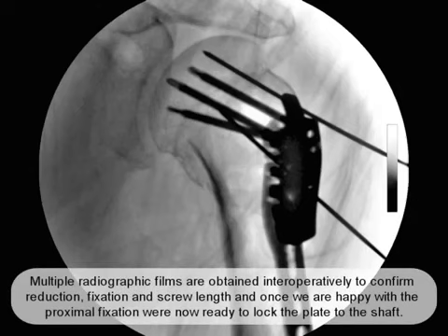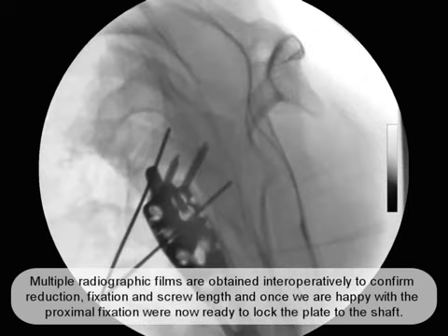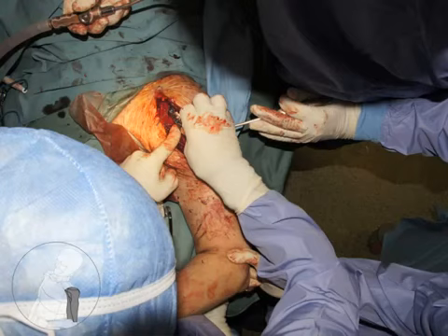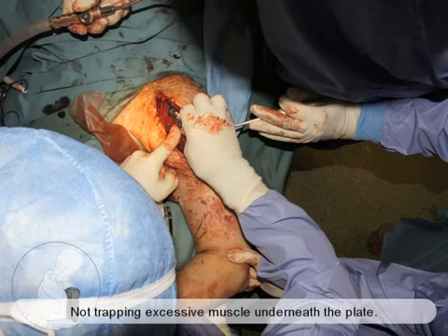Multiple radiographic films are obtained intraoperatively to confirm reduction, fixation, and screw length. And once we're happy with our proximal fixation, we're now ready to lock the plate to the shaft. At this point, the proximal guide is removed, and we're prepared to lock the plate to the shaft distally. At this point, you need to confirm that your plate is sitting in the appropriate position, and that you are running down the deltopectoral interval and not trapping excessive muscle underneath the plate.